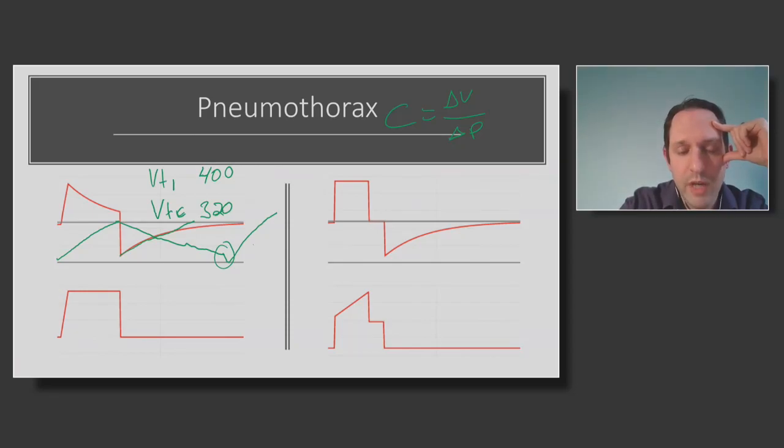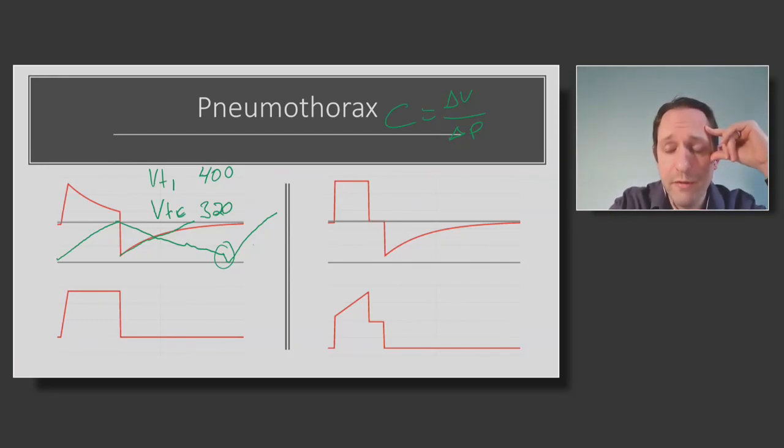And of course, watch your patient closely. You're going to auscultate your patient, see if you hear any breath sound differences. That's more of a concern because you need to know why that's happening. Now in volume assist control, your volume is not going to change, but what will change is your pressure because you've controlled your volume. So this is not only going to go up, but so will your plateau.